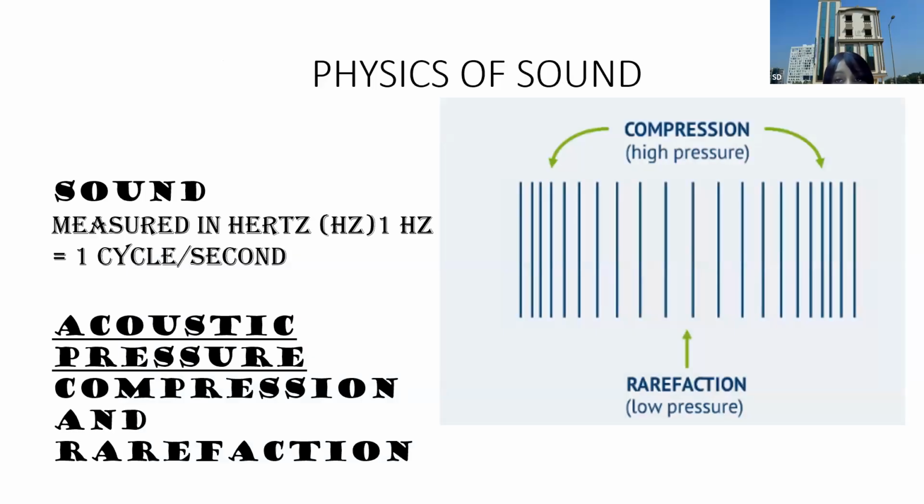Coming to the physics of sound, the mechanical pressure wave travels in a medium and it is a longitudinal wave. That means it travels only in one direction. And we find that there is compression and there is rarefaction.